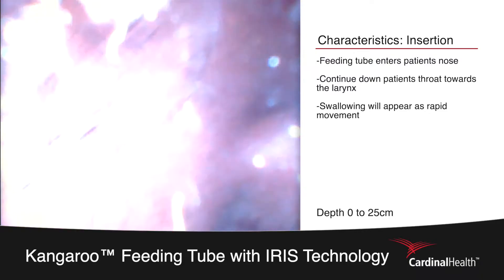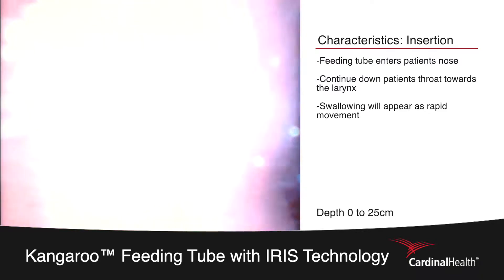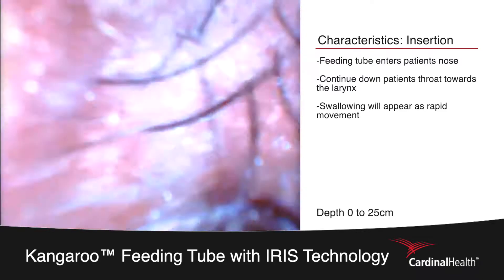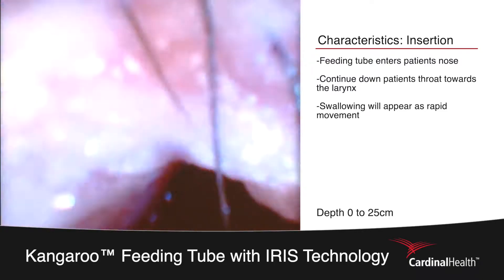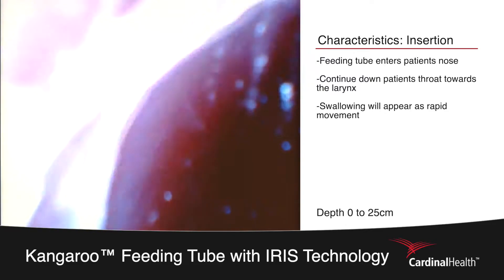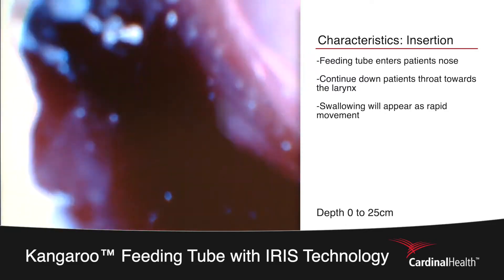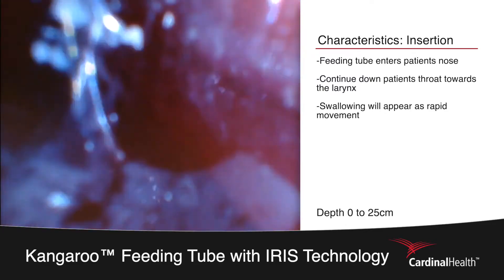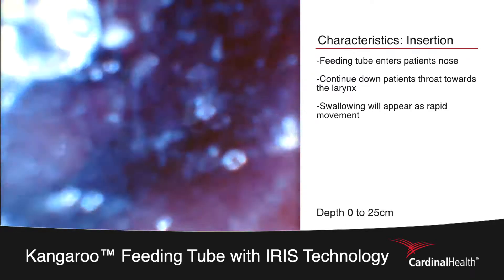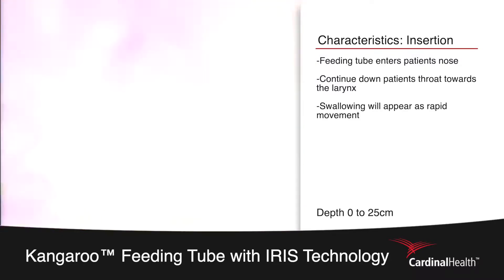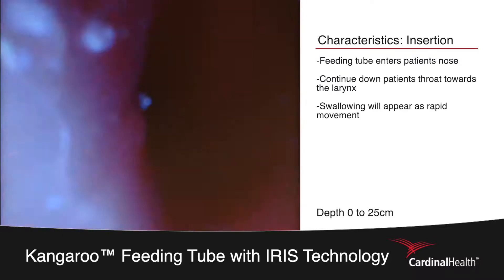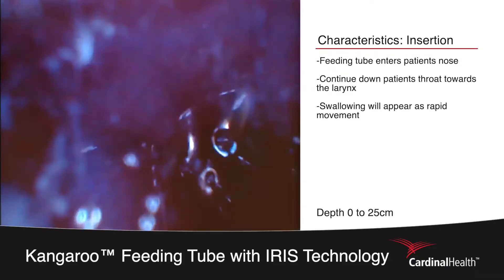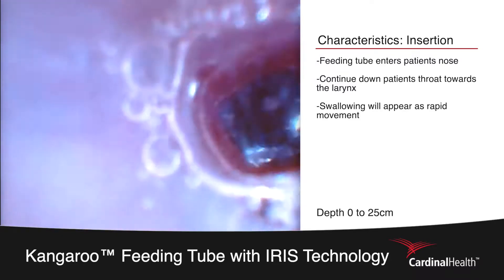The procedure begins with the placer inserting the feeding tube into the patient's nose, as can be seen by the nasal hair. The tube then progresses down the back of the patient's throat heading towards the larynx. We visualize some rapid movement, which is the patient swallowing to assist with feeding tube placement.